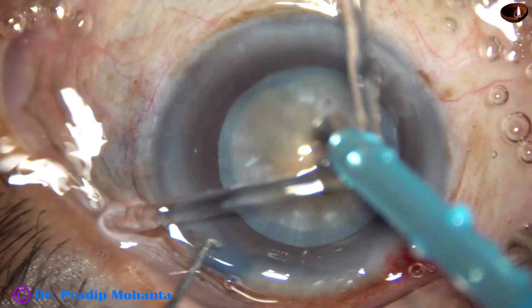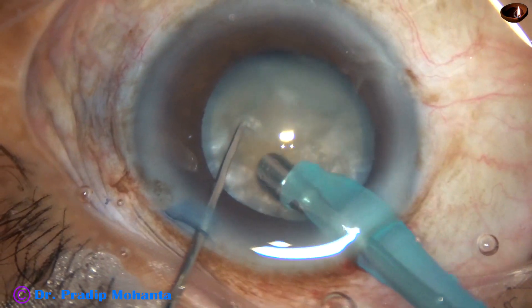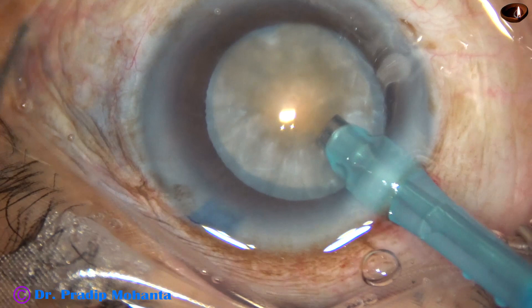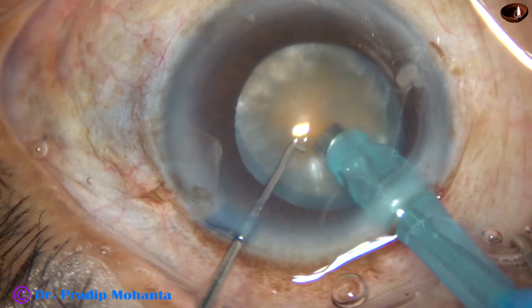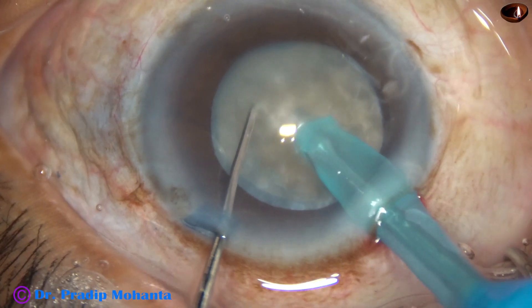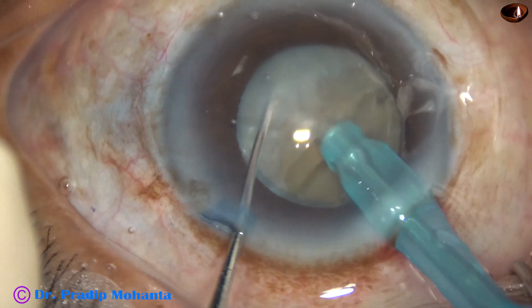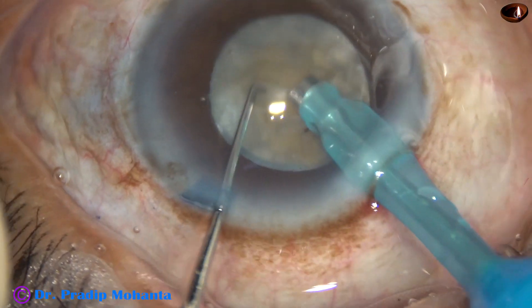Now the tip of the phaco handpiece is introduced into the anterior chamber. See the direct chop — some superficial cortical matter is removed, the handpiece is turned, bevel is up towards the cornea. The tip is buried into the substance of the nucleus and the nucleus is held with high vacuum very firmly. Then the chopper is used to divide the nucleus into two halves.